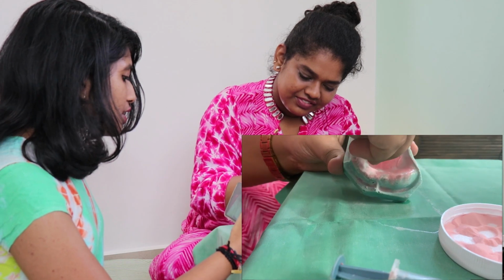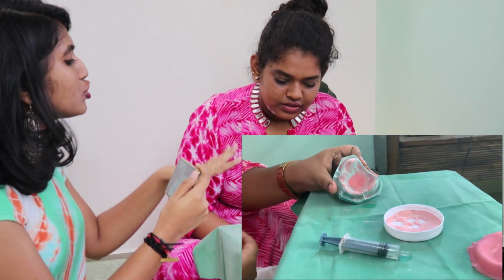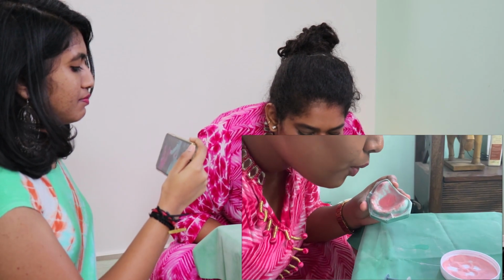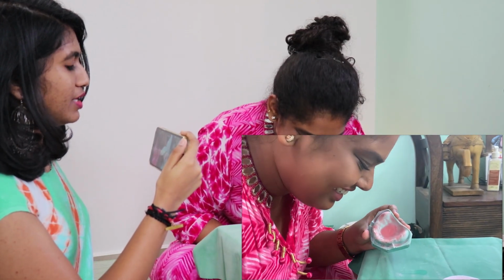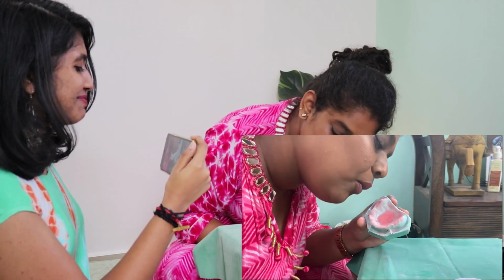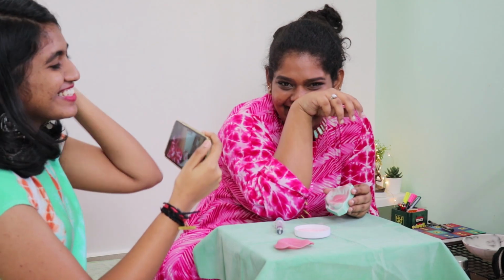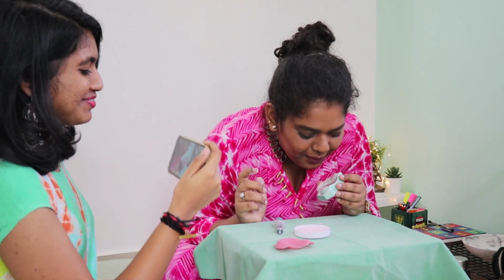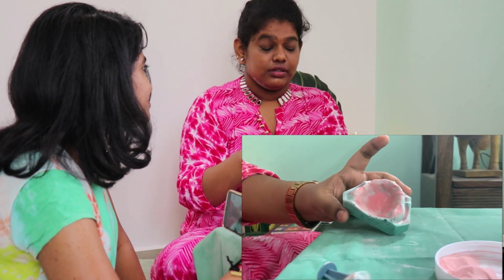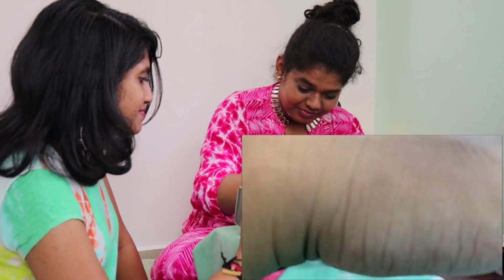If you put more liquid, there won't be much porosity. I've tried blowing it and making it dry, semi set. Don't inhale, just blow. Only as much liquid as needed. But yeah, that happens.